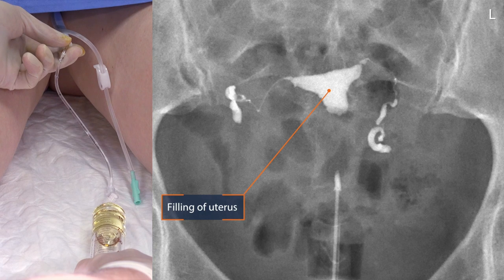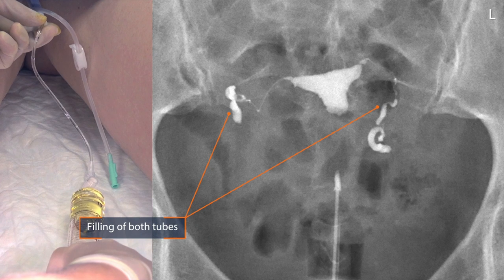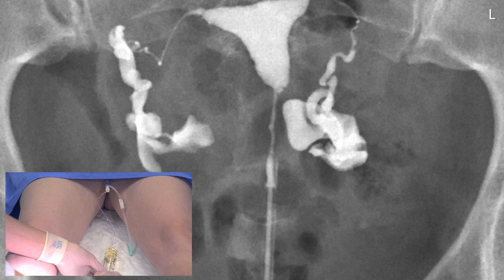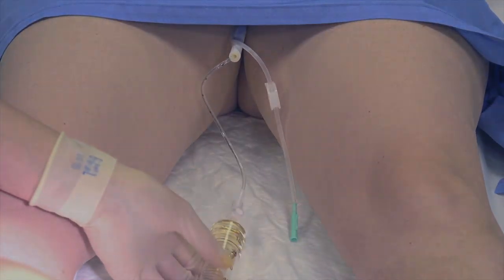Over here you can see the filling of the uterus, and you can see the filling of both tubes. Now we make a couple of pictures during infusion to check if we will see the oil drops coming out of both tubes. Both tubes are open.